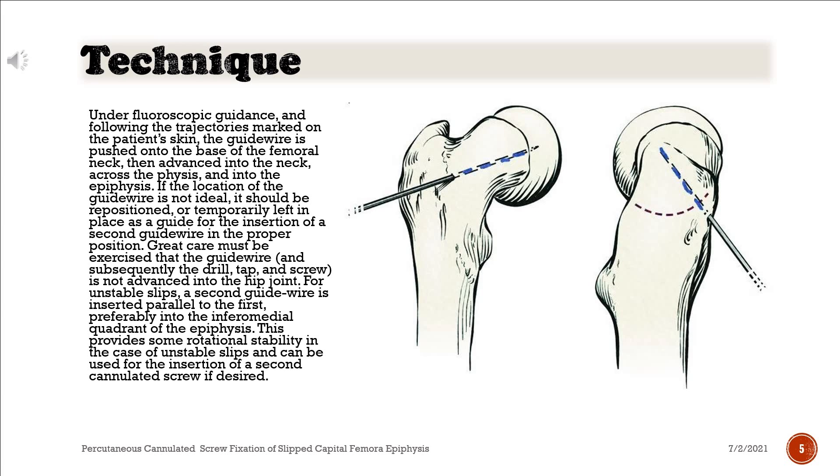Under fluoroscopic guidance, and following the trajectories marked on the patient's skin, the guide wire is pushed onto the base of the femoral neck, then advanced into the neck, across the physis, and into the epiphysis. If the location of the guide wire is not ideal, it should be repositioned, or temporarily left in place as a guide for the insertion of a second guide wire in the proper position.